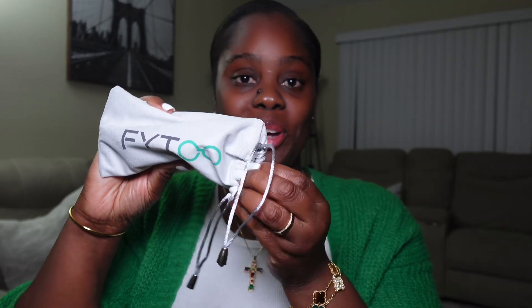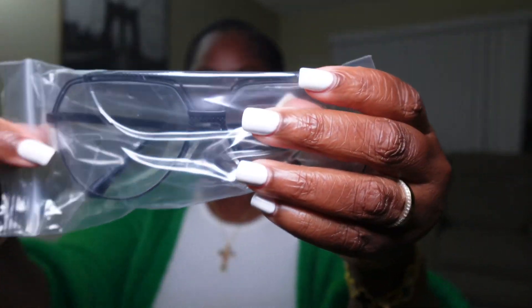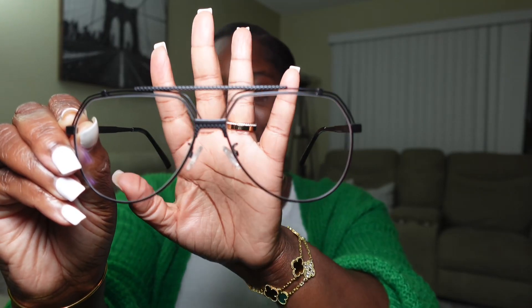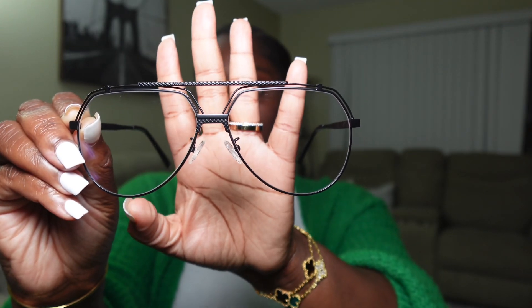This is the third one — branded Fytoo on the case. Also a cleaning cloth in this one. I love this one because it's plain, and it's giving oversize. Sometimes you just want glasses with no color on it, so this one is definitely for when you feel simple and plain. I love the way it sits on my face — I don't have to adjust any of them, they just come perfect.